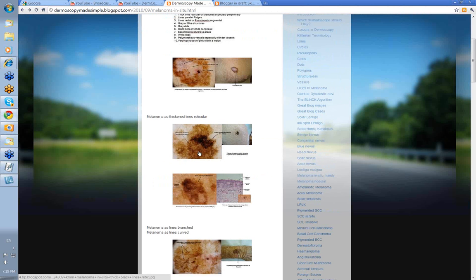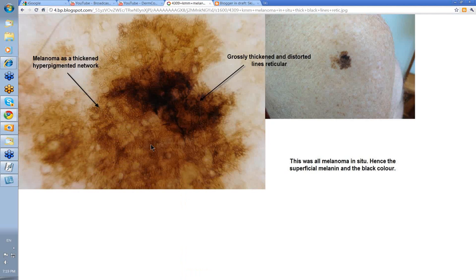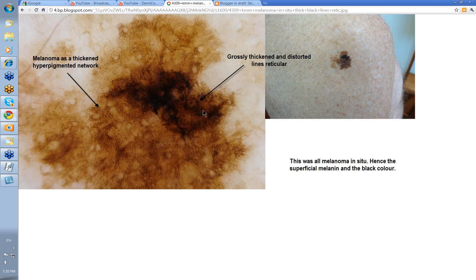Let's get on to melanoma as thickened lines reticular, especially peripheral. Clinically in a lot of these you wouldn't need a dermatoscope — that's a melanoma just looking at it. Look at the varying shades of pigmentation, very black and dark indicating most of your melanin is superficial. You've got your thickened hyperpigmented network and a grossly thickened and distorted lines reticular. All of this was melanoma in situ, so the melanoma is very superficial and hence the black color.